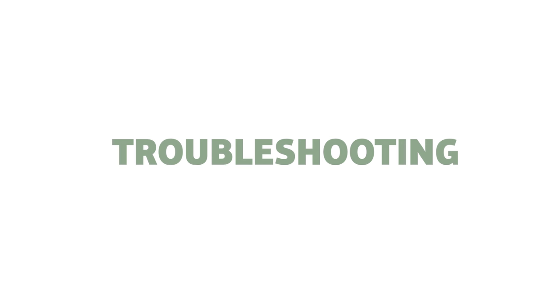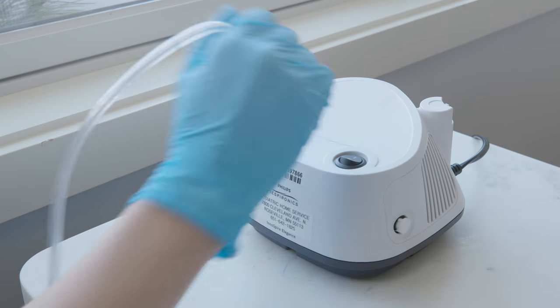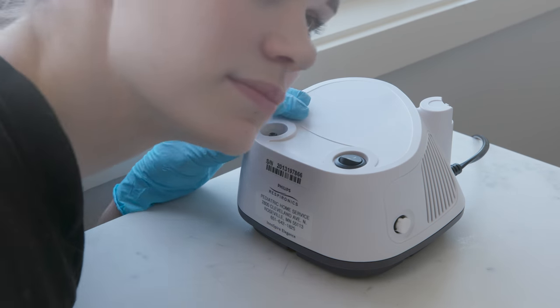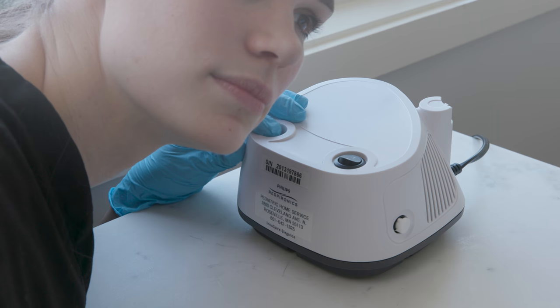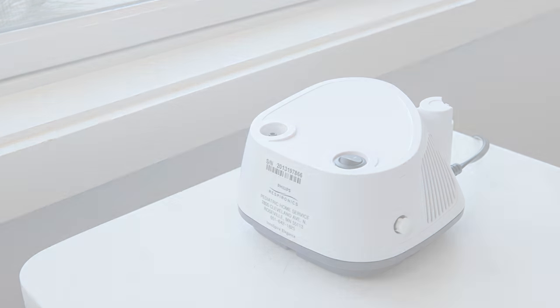Follow these troubleshooting tips if there is no mist from the delivery device at the beginning of a neb treatment. First, check for airflow from the neb machine. Disconnect the neb tubing and put your finger over the air outlet port on the machine to block airflow. Remove your finger and listen and feel for a burst of air.